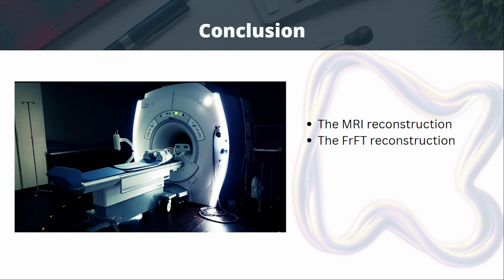Discussion and conclusion. The MRI reconstruction is done by an inverse FT. This method rests on the basis that the object has been magnetized with a perfectly uniform magnetic field and encoding using linear gradients. In a situation where these conditions do not hold and nonlinear fields come into account, second-order components are their first and simplest approximation. We present a new framework for quadratic field MRI analysis based on the FRFT. It establishes the theoretical relation between image space and quadratic magnetic field signals' frequency space, allowing native second-order field image reconstruction.